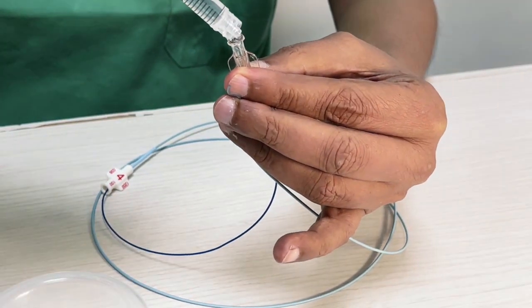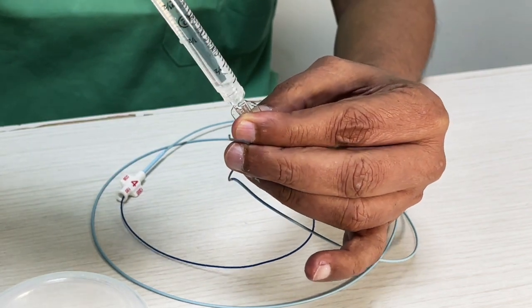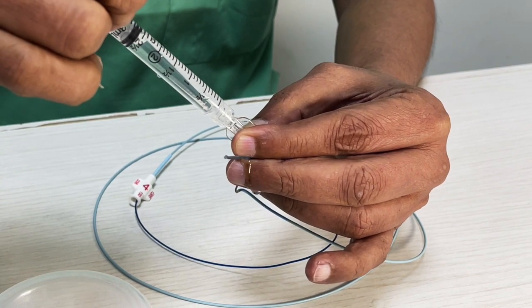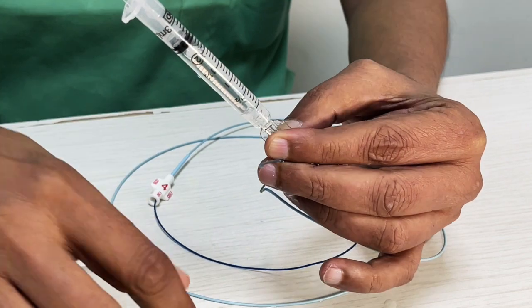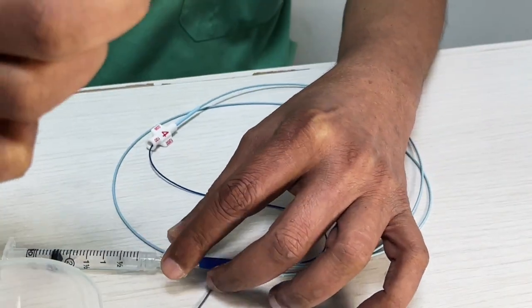So we connect this here. Now you should ideally inject it really fast, so it just comes out, but I'm going to do it reasonably slow so that it sort of comes out. Did you see that come out? I hope you saw it, because here it is.